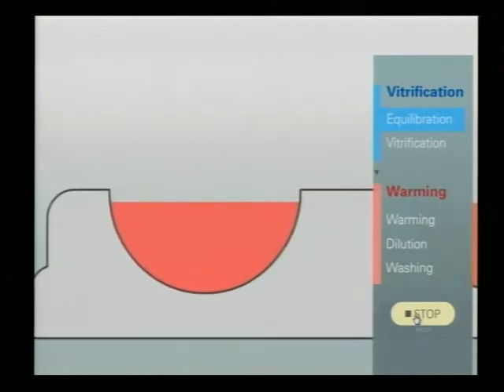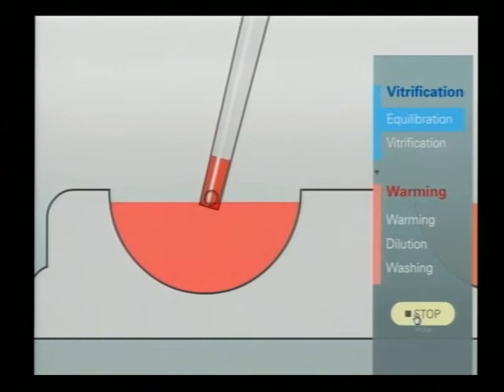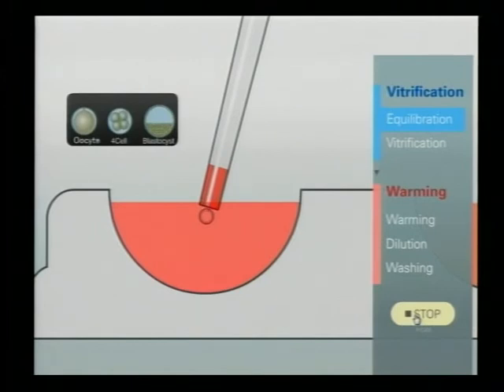Then we start the incubation. We pick up the oocytes, embryos, and blastocysts for the vitrification. We place the embryo and the oocyte in the center of the solution gradually with some amount of this culture medium. This gradual exchange with the solution is very important to minimize the damage of the drastic change of the osmolality. Just put on the surface and then oocyte will sink slowly and finally mix with solution.